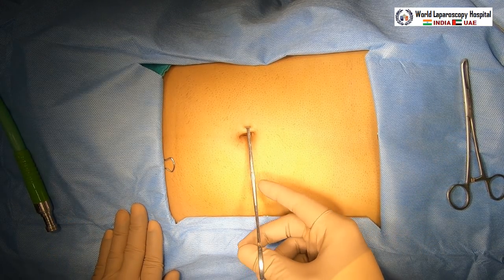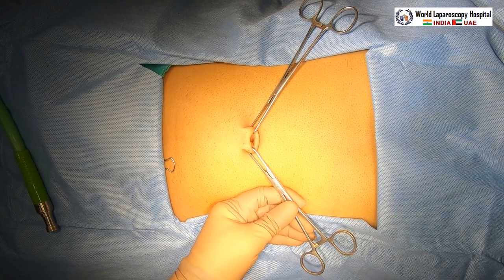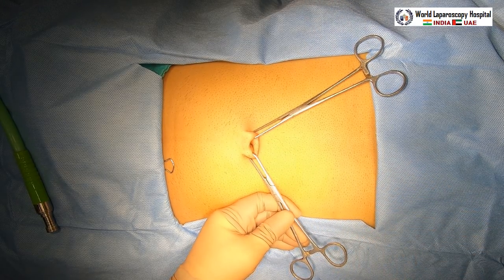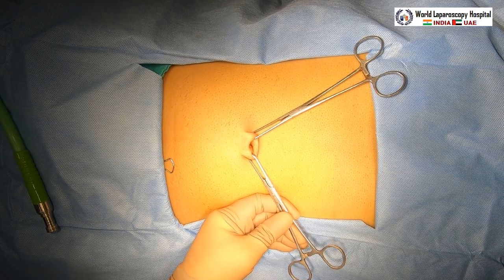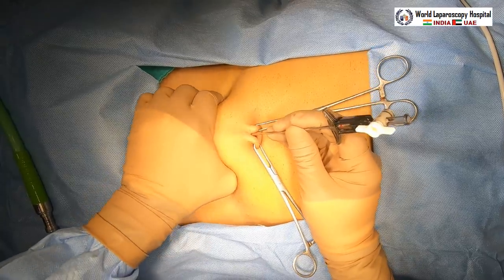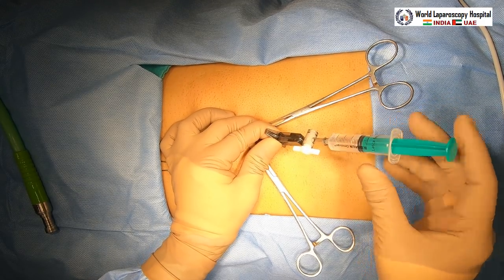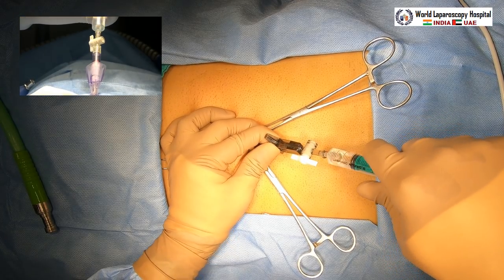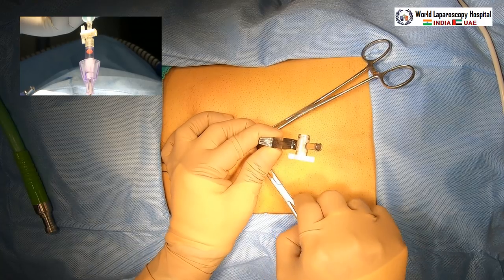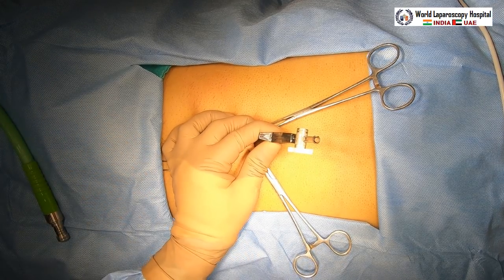The patient is fully anesthetized and relaxed. Two Alice forceps will be applied on either side. An 11-number knife will be taken and a stab wound given over the inferior crease of the umbilicus. Then the Veress needle is taken and, by lifting the abdominal wall perpendicular to it but oblique to the muscle, you introduce the Veress needle with a two-click sound. After that, perform the irrigation test, followed by the suction test and hanging drop test. These tests are essential to confirm the Veress needle is in the appropriate place, after which you attach the insufflator tubing.